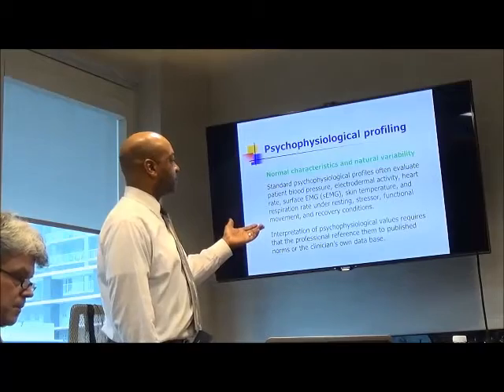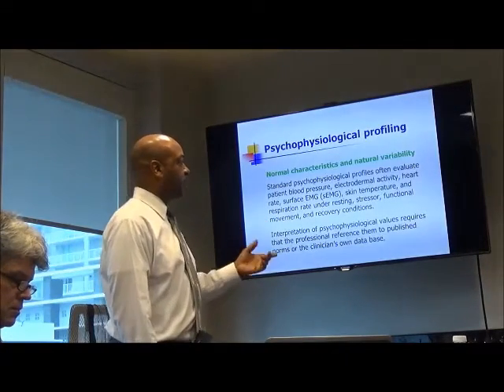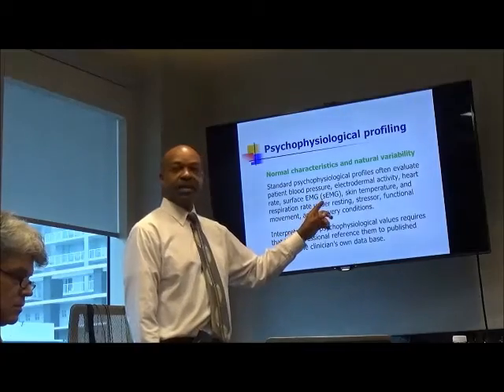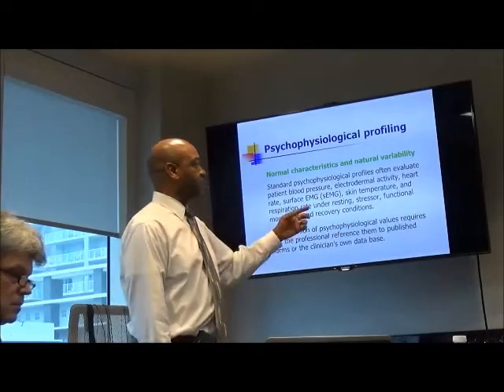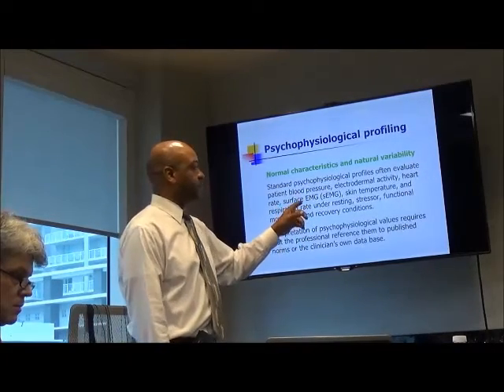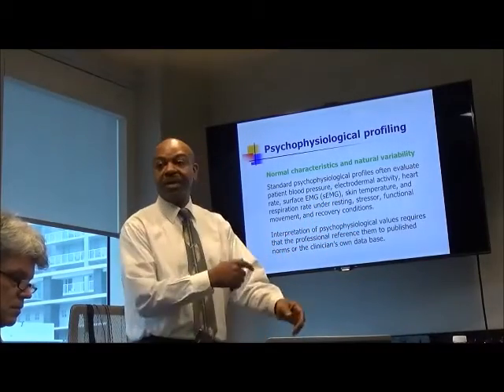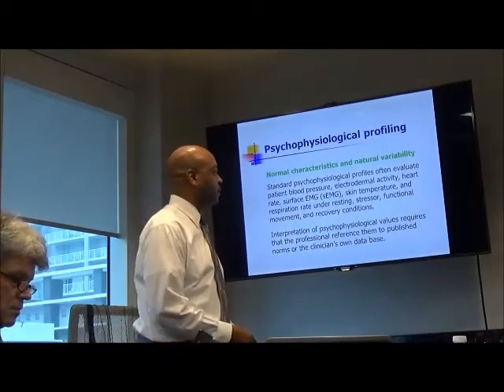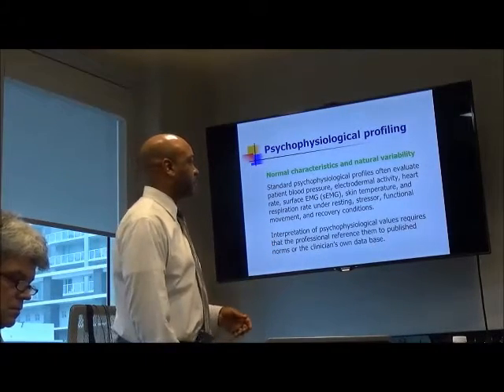Then you have the surface EMG. And by the way, when you see the S in front of the EMG, it just means surface EMG. So sometimes you'll just see it listed as EMG, and sometimes you'll see surface EMG, or just the S in front of the EMG just means surface, that we're not using the needles. That would be for diagnostic purposes, which we talked about.